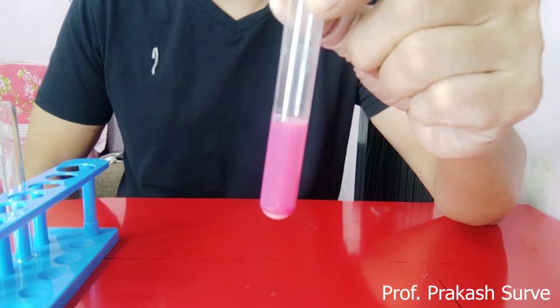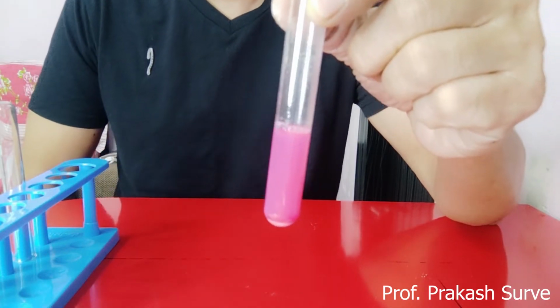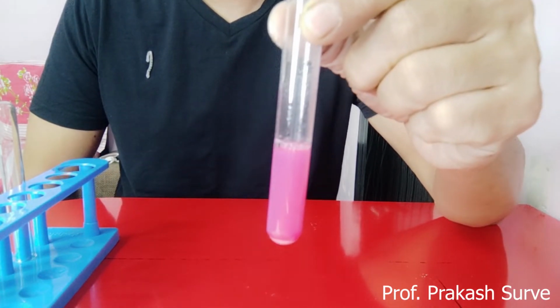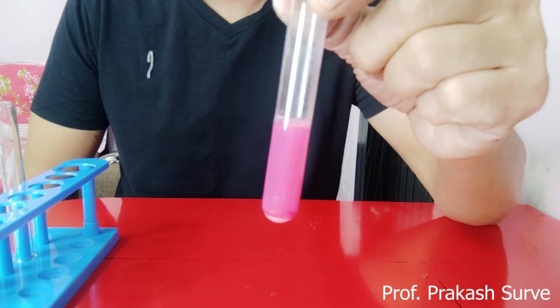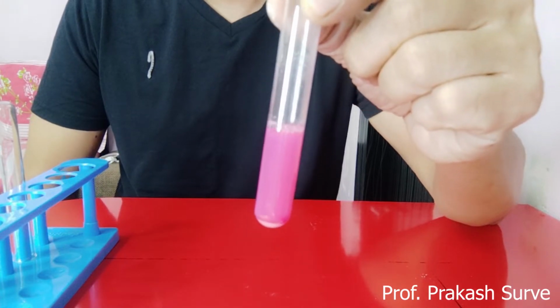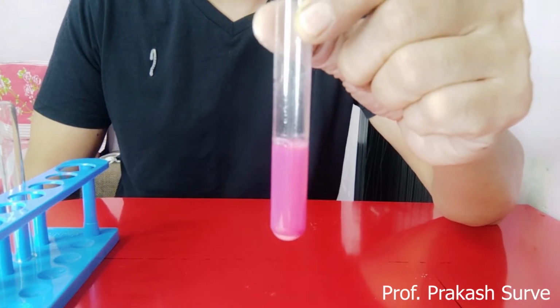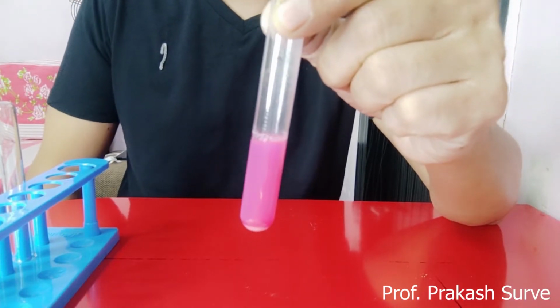So what did we add in this? In the urine sample we have added soybean flour. Soya provides urease, which catalyzes the urea into ammonia and carbon dioxide. Ammonia, being alkaline, reacts with the phenolphthalein and develops this pink color. So this pink color indicates that urea is present in the urine sample.